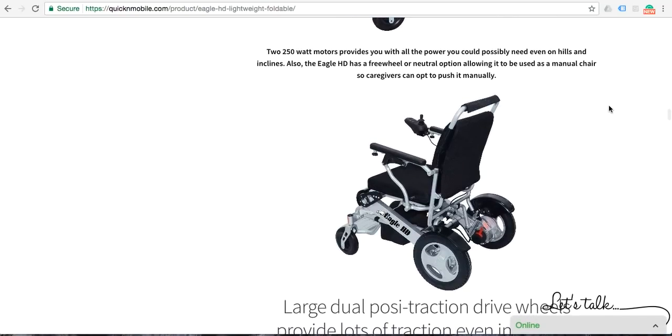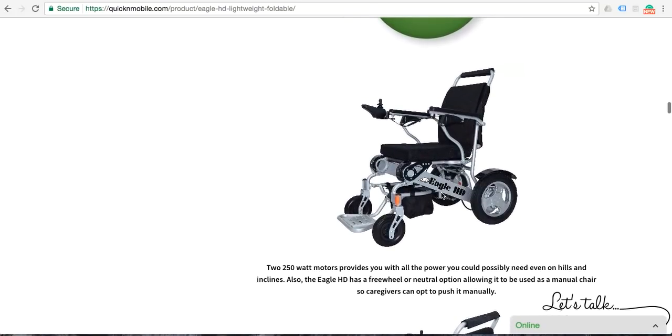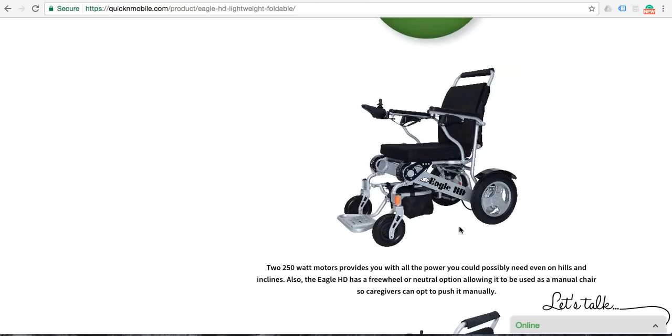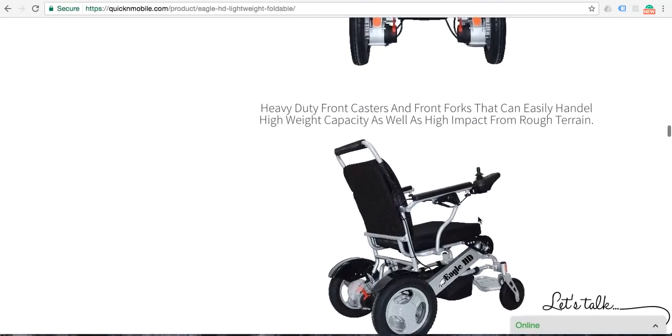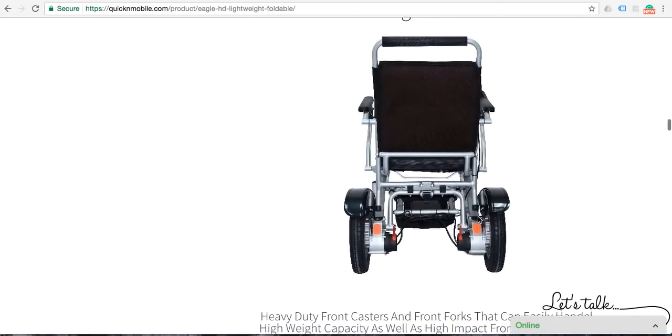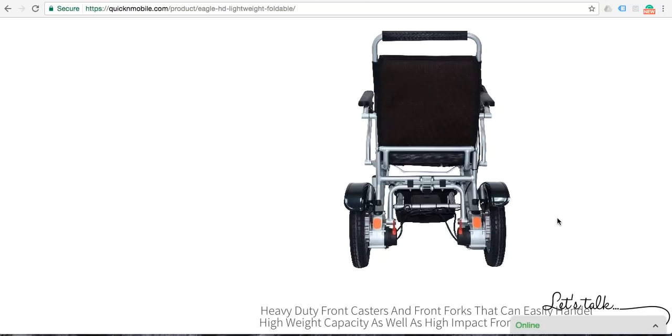So a caregiver could push this chair manually, or if you wanted to get exercise in the chair, you could put it in manual mode and you could just very easily flip the footrest up and walk the Eagle around and make it, in many ways, a physical therapy chair if you chose to do so. Moving forward, this is just a look at the back of the chair, an easier look at the switches on the motors to engage either the motor or to make it a manual power chair.